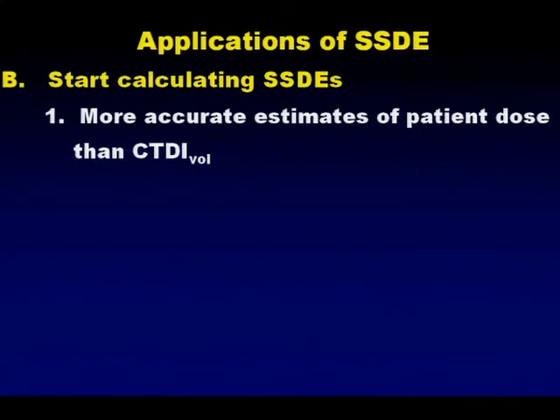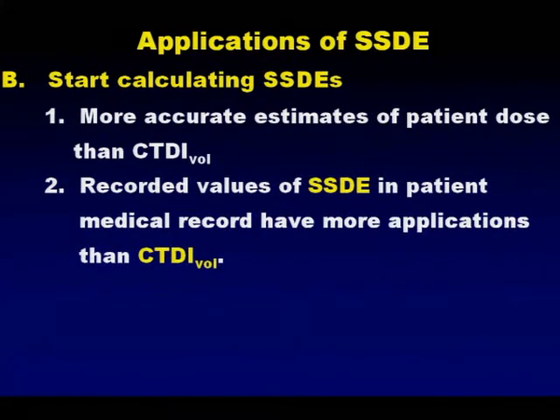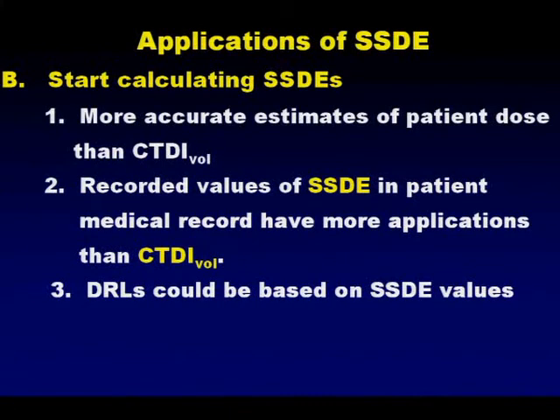We need to start calculating SSDEs. I've given you some examples of how they're more accurate estimates of patient dose than CTDIvol. I'd like to see SSDEs as opposed to CTDIvols recorded in the patient's medical record. It's a better representation of the patient dose.